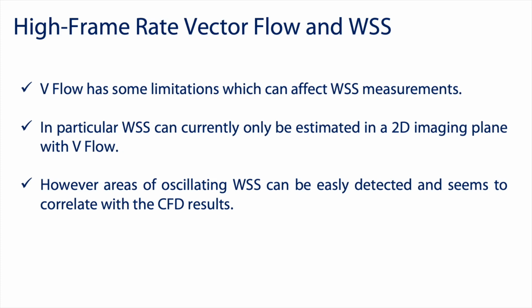Preliminary research findings are encouraging and show that high frame rate wall shear stress values seem to be comparable with the CFD wall shear stress ones. And if the preliminary findings are confirmed, high frame rate vector flow could identify patients at a high risk of plaque development or plaque rupture.